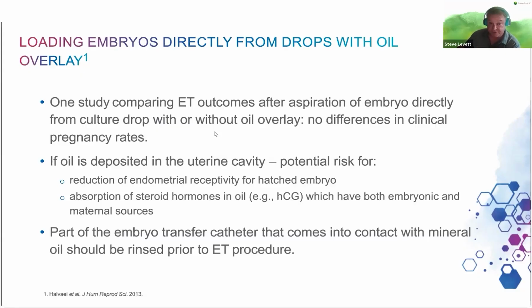So they're going into the dish, taking the embryo. You may have oil on the top or not. There was no difference in clinical pregnancy rates. If you are using oil, you have to have some consideration for it. And the part of the embryo transfer catheter that comes into contact with oil should be rinsed prior to embryo transfer.